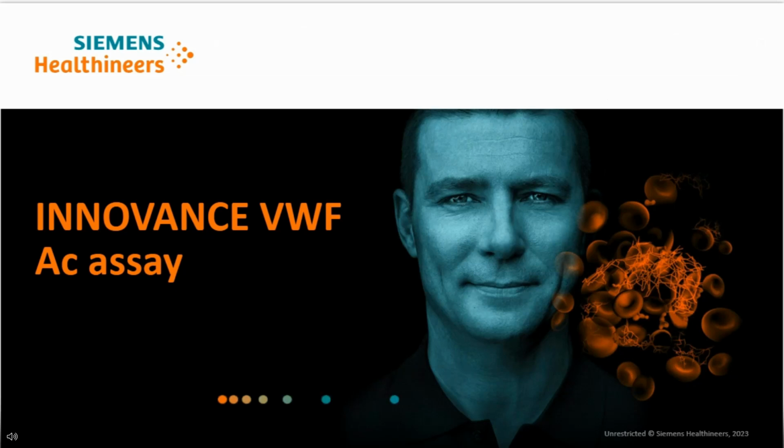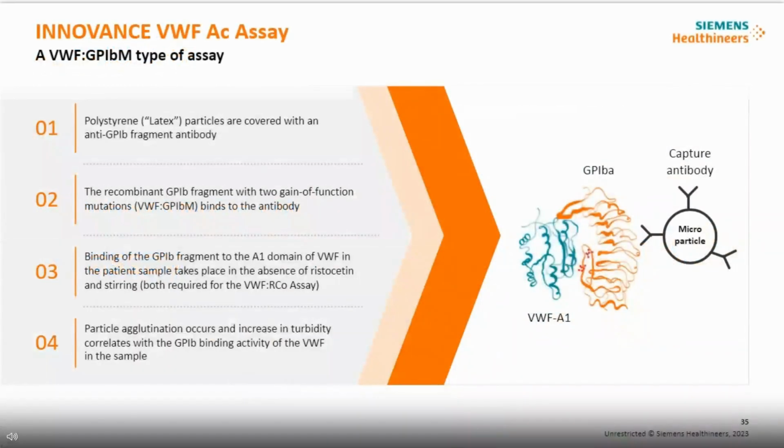I want to quickly change gears and talk about the Innovance von Willebrand activity assay that was recently cleared by the FDA here in the United States. So we talked about this assay before.